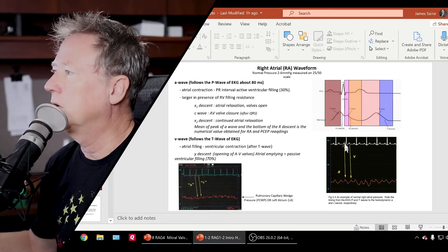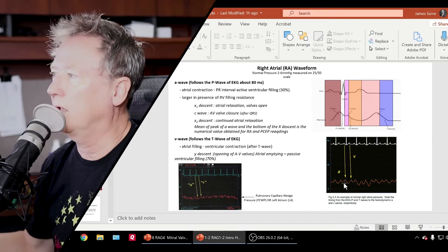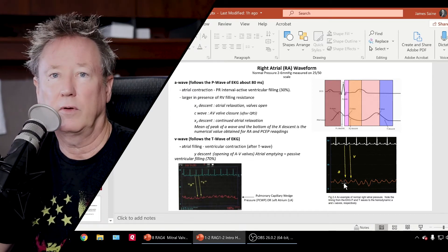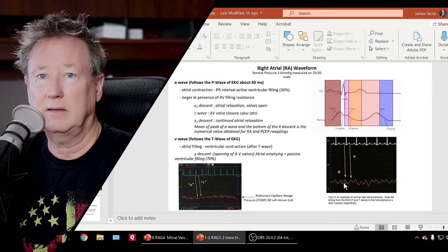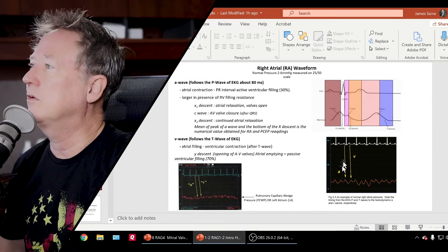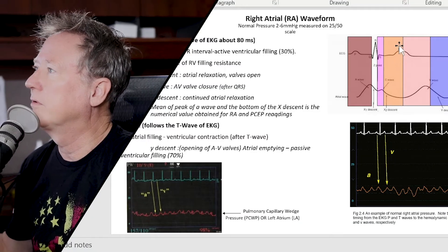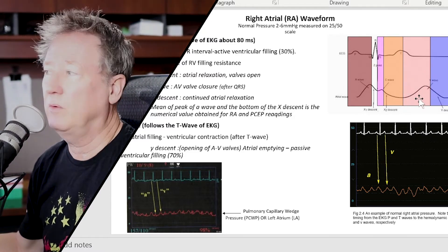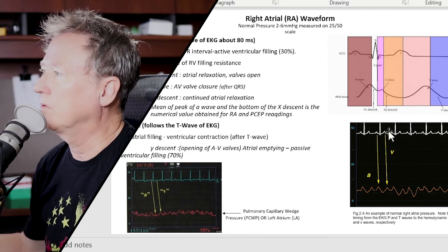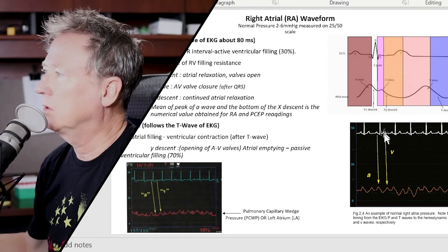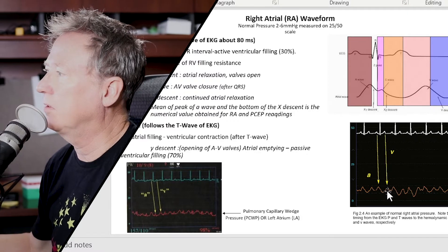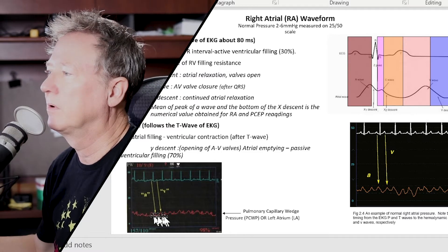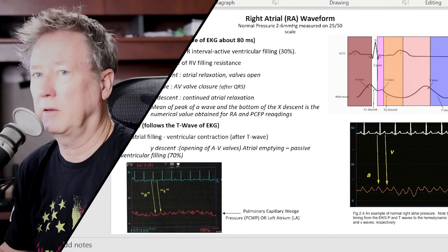Here are a couple of examples: find the P wave, come straight down, and the next hump over is the A wave. The V wave follows the T wave on the EKG, so the V wave is in that T-P area. If you find the T wave on the EKG and come straight down, the next hump on the waveform is the V wave. So this is the V, this is the A. On the right atrial waveform it's going to be about 80 milliseconds.